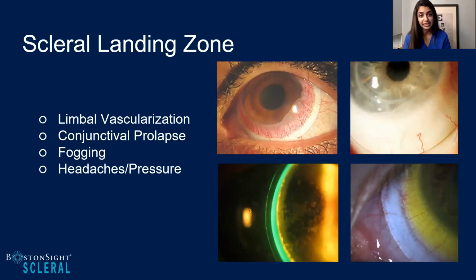Yeah, you're so right. The analogy I like to use, which I hope to share with the group today, is I oftentimes describe to a patient a scleral lens you can compare to a good pair of shoes.